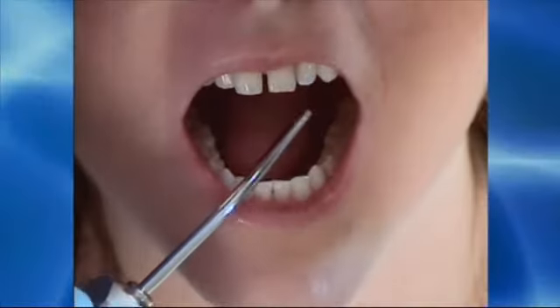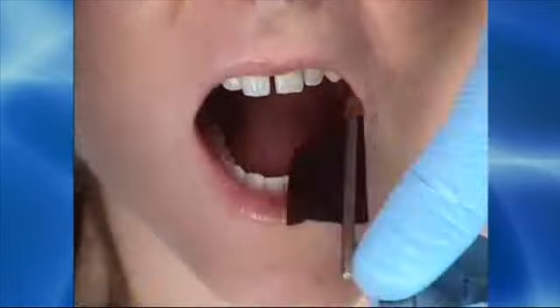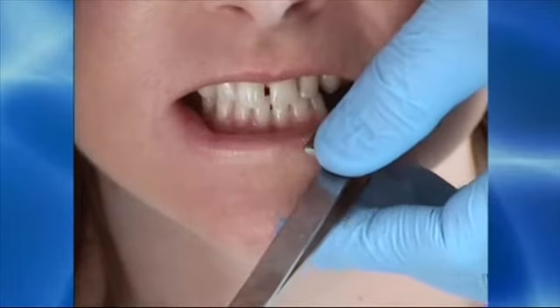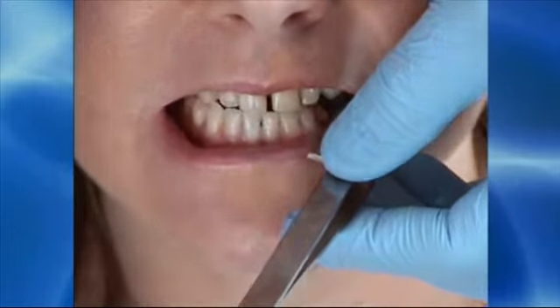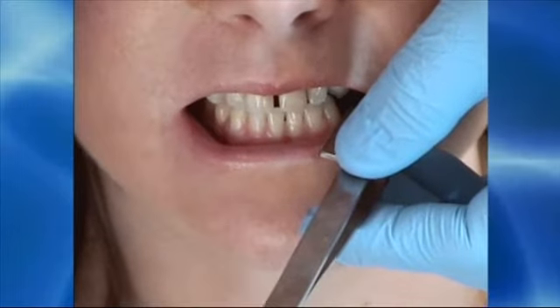To mark the left side, insert the articulating paper after drying the teeth well. Have the patient intercuspate, slide to their right and to their left, back into their intercuspal position, then to the right and to the left again.